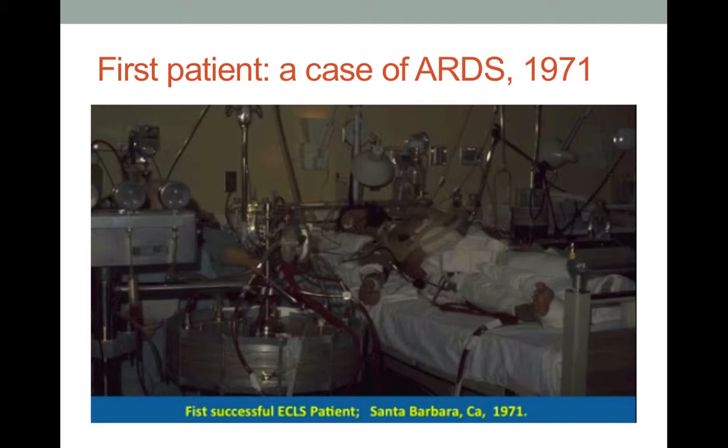So when a patient arrived who was in a motorcycle accident and had a ruptured thoracic aorta and wound up with ARDS, as with many patients with ARDS, he just needed time. He had his aorta repaired, obviously, but he needed time for his lungs to recover. So they did a veno-venous bypass, and he was on ECMO for a day and a half and survived.